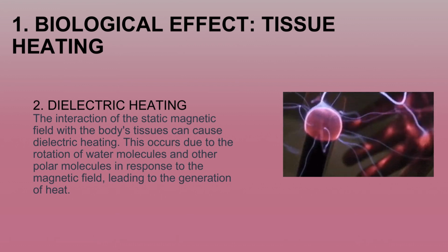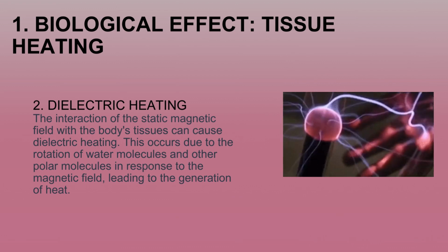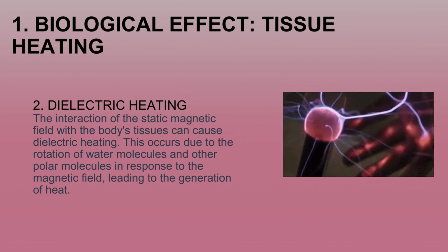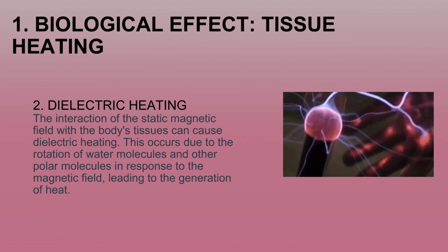Dielectric heating. The interaction of the static magnetic field with the body's tissue can cause dielectric heating. This occurs due to the rotation of water molecules and other polar molecules in response to the magnetic field, leading to the generation of heat.